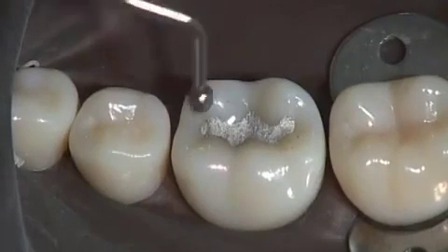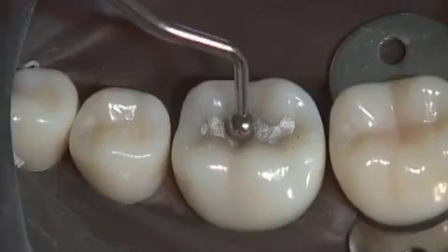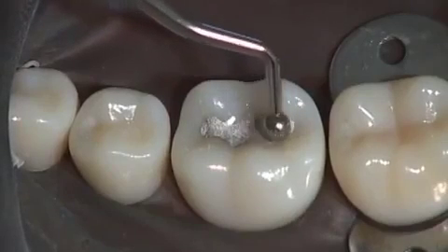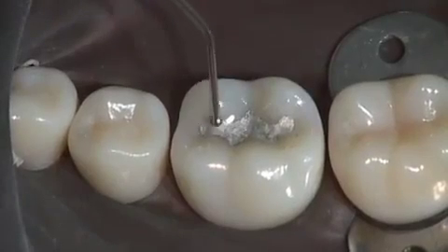At the end of setting, you can perform some post-carving burnishing to solidify and further highlight the primary anatomy of your restoration.